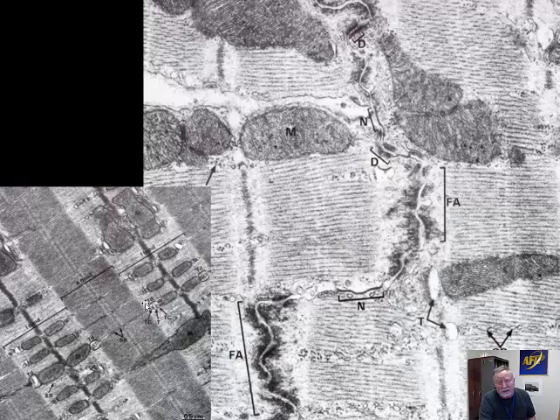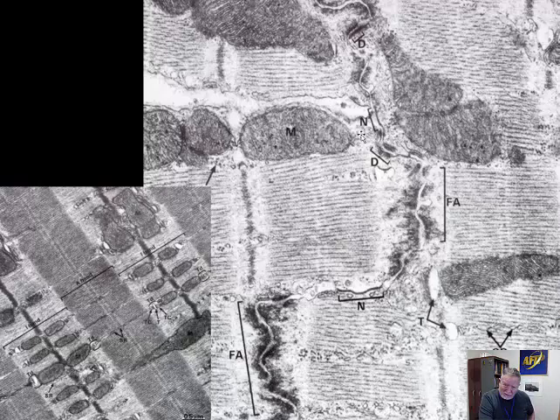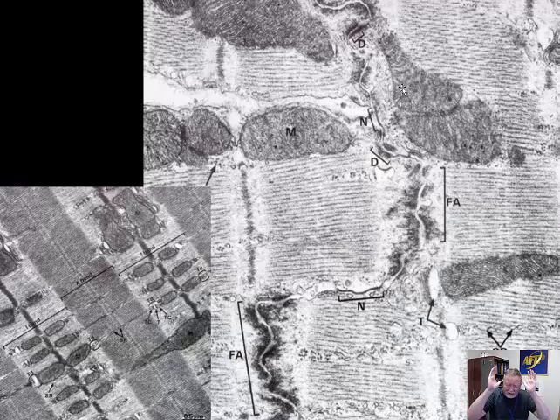When you get into cardiac muscle, everything is a little different — it's not really in register. They are offset, off kilter. Your Z-bands, or intercalated discs, sort of flow around like a lazy river. The mitochondria are on end and don't line up very nicely. So when everything is a little bit out of kilter, you're probably looking at the heart. When everything is just regimented, you're looking at traditional skeletal muscle.